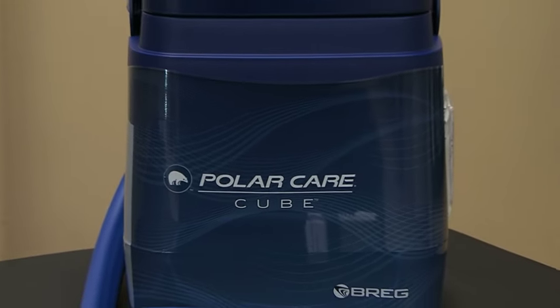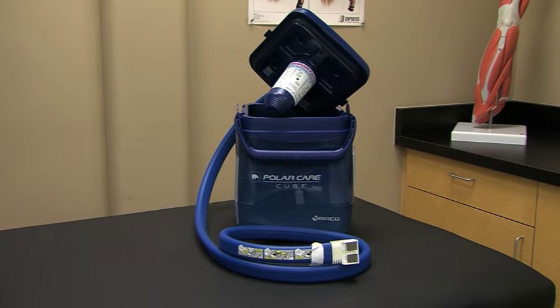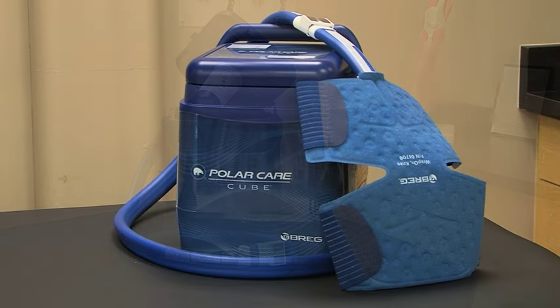This is PolarCare Cube, one of the newest innovations in motorized cold therapy. This system is lightweight, compact, and easy to use.